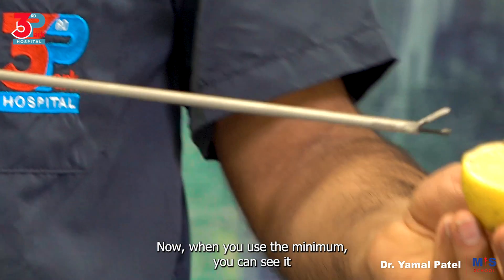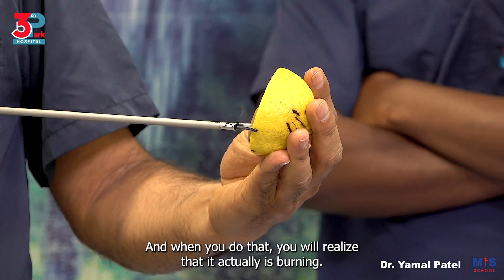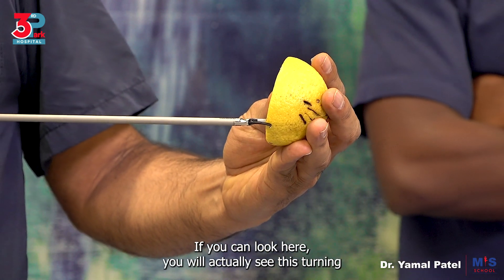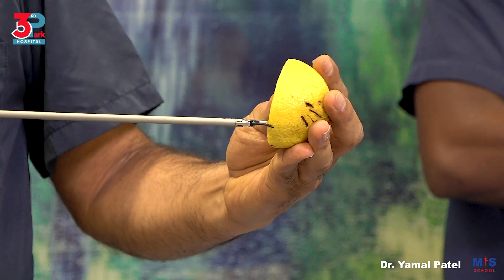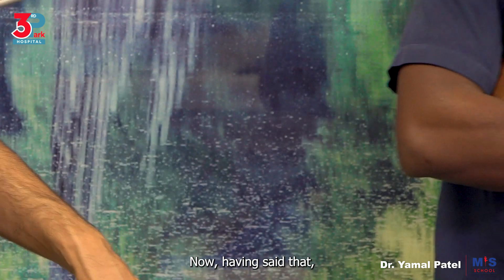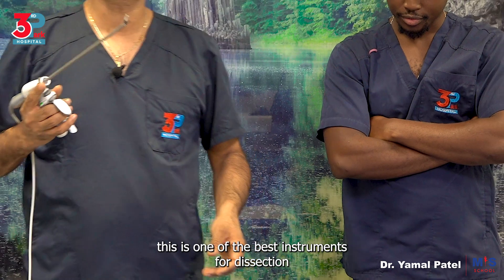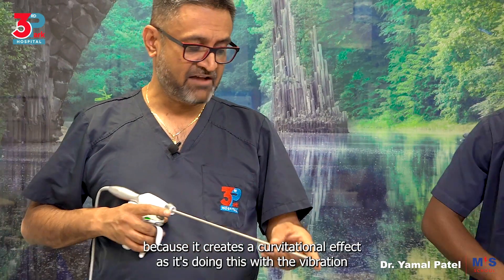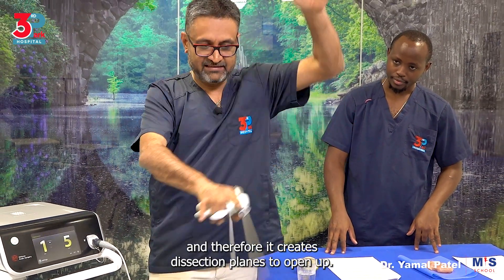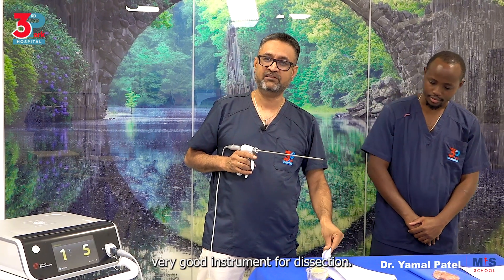When you use the minimum setting, you can see it actually is doing it but slowly. And when you do that, you will realize that it is actually burning — if you look here you will see this turning black. So that is buzzing as you're continuing. This is one of the best instruments for dissection because it creates a cavitational effect with the vibration, and therefore it creates dissection planes to open up. So it's a very good instrument for dissection.